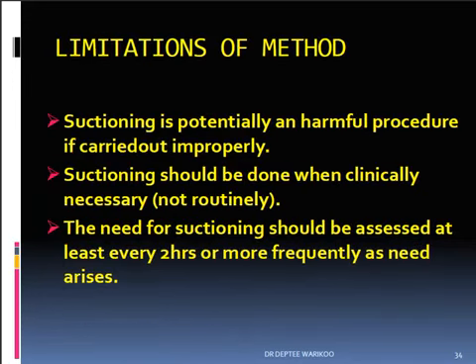There are some limitations to the method. Suctioning is a potentially harmful procedure if carried out improperly. So you need to be properly trained before giving suctioning. Suctioning should be done when clinically necessary, not routinely, and the need for suctioning should be assessed at least every 2 hours or more frequently. So not given before assessment. If needed, then only given, and given by a properly trained clinician. These are the basic principles you have to make sure you maintain while giving the suctioning.